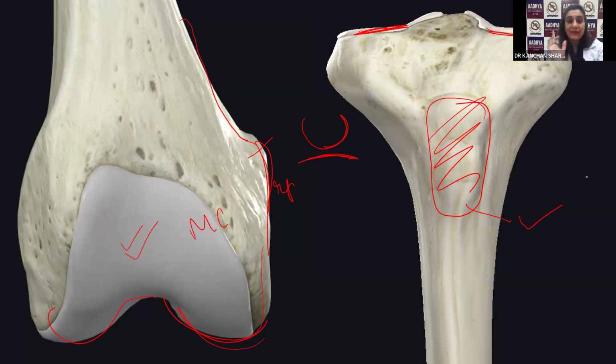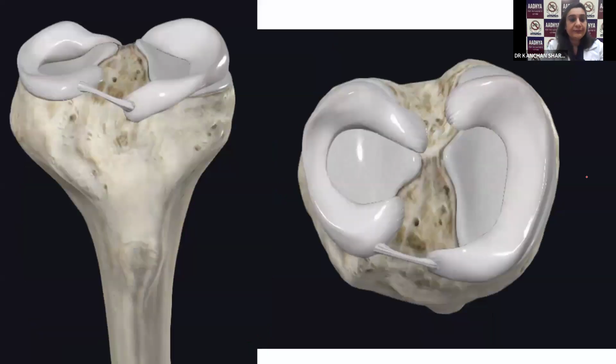So what all we have understood from these two slides is femur condyles are rounded, tibia is flat, right? And your patella base is up, apex is down, and you need to see the apex becoming broader fully, right? Not only do you need to scan just the tip, but yes, we need to scan it nicely on both aspects. Then you should know about the tibial tuberosity, fine, and the trochlear cartilage.